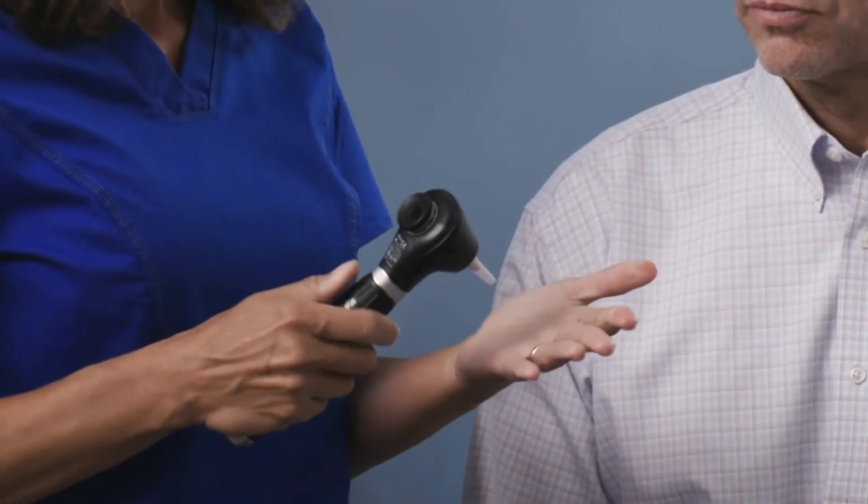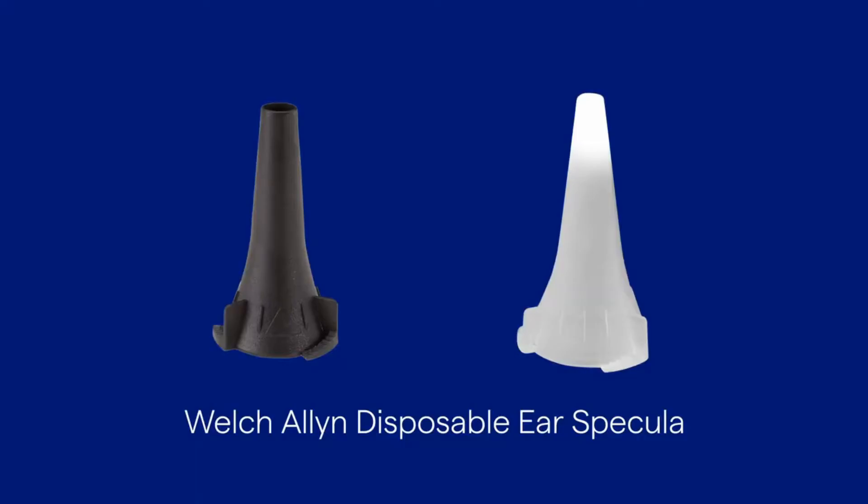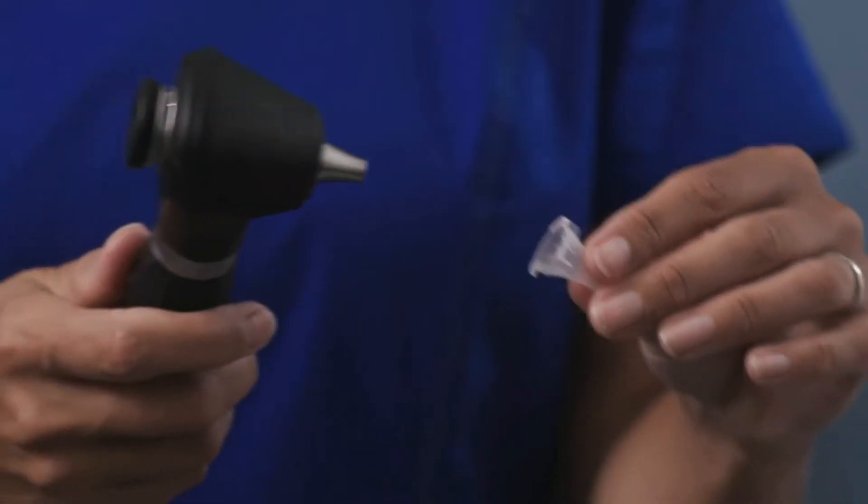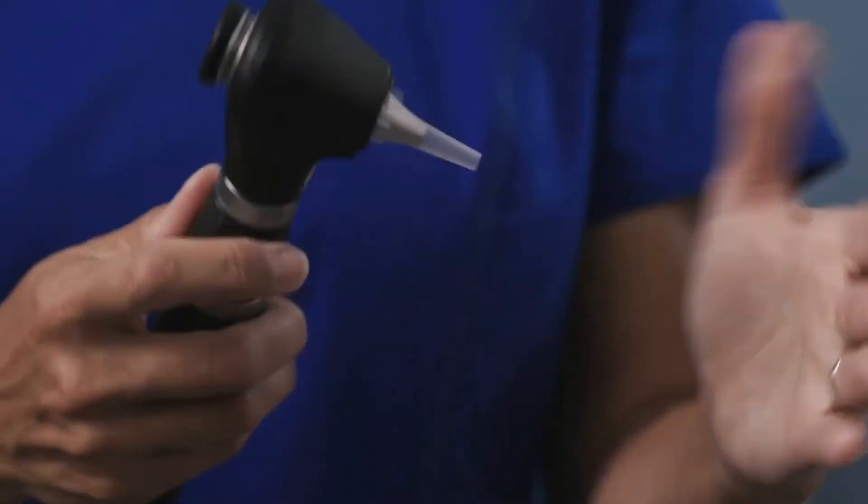With any ear exam, you will want the patient to sit down and slightly tilt their head away from you to obtain easier access to their ear. Attach an ear speculum sized to best fit the patient. Disposable specula for the macro view are available in a variety of sizes. Turn the speculum clockwise until it's secure.